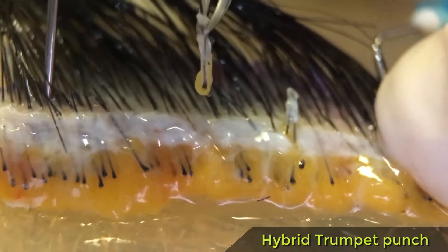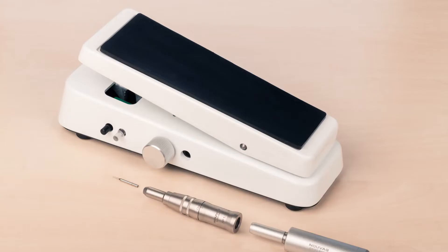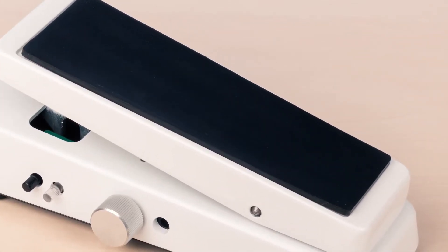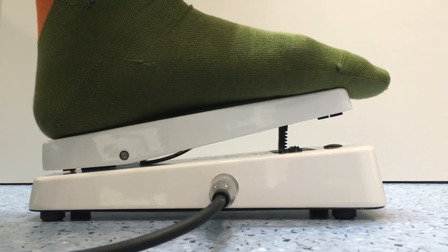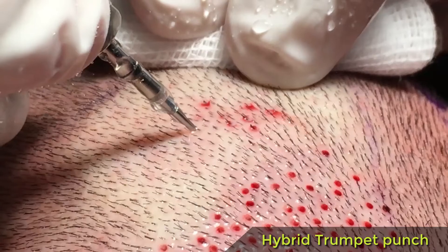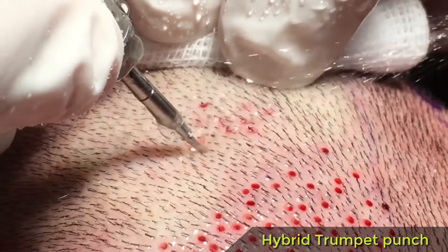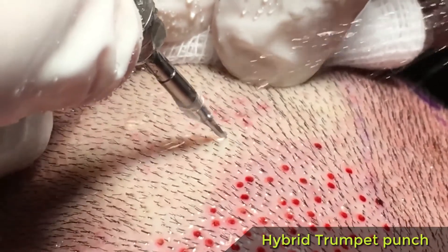I had to find the ideal punch profile that, combined with an oscillatory motion, would provide a very smooth extraction. That's exactly the point of the hybrid trumpet punch and the foot pedal. The pedal is designed to reproduce the manual motion while providing more power even at low speed and offering greater accuracy. The best option is a movement with a low rotation speed and a small angulation, performed in the shortest time possible.